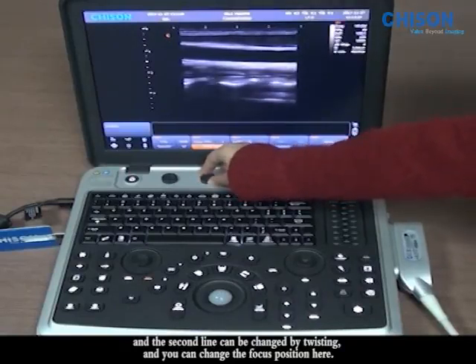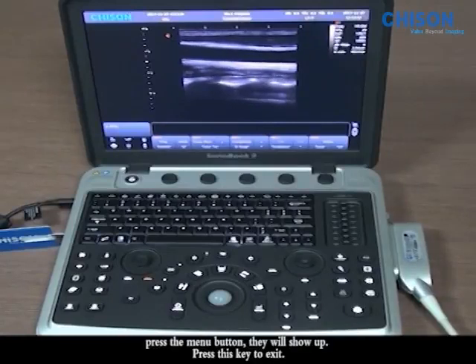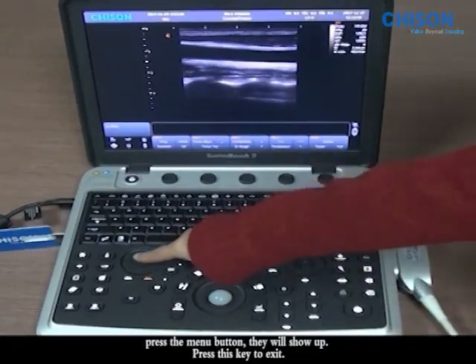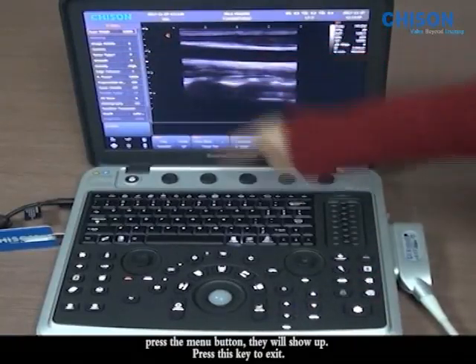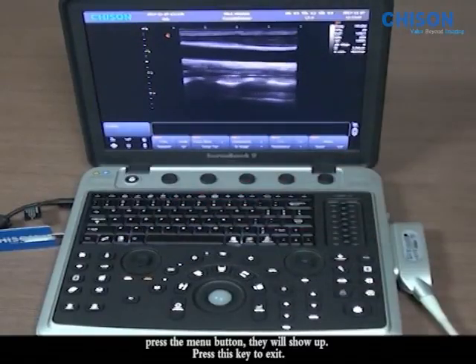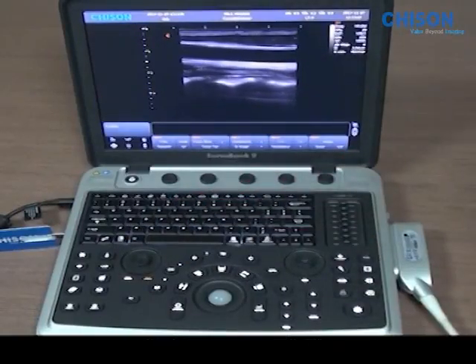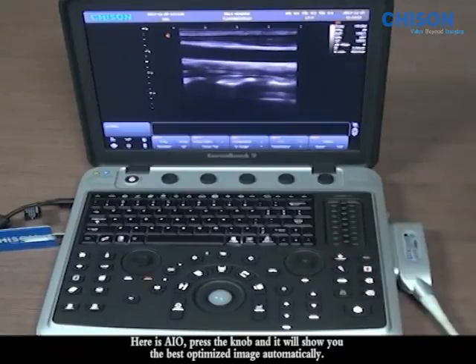Also, we have some other parameters. Press the menu button, and they will show up. Press this key to exit. Here is AIO. Press this knob and it will show you the best optimized image automatically.